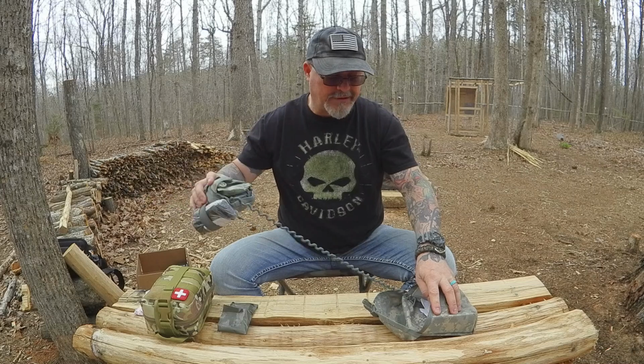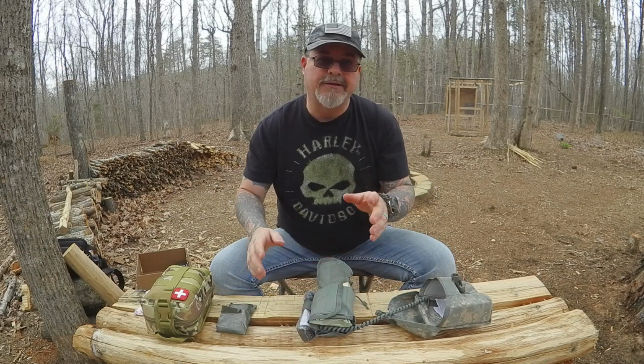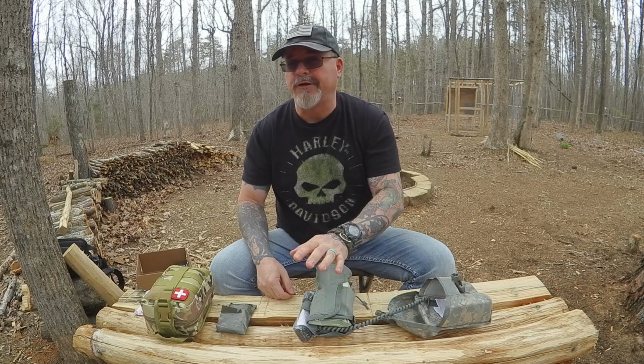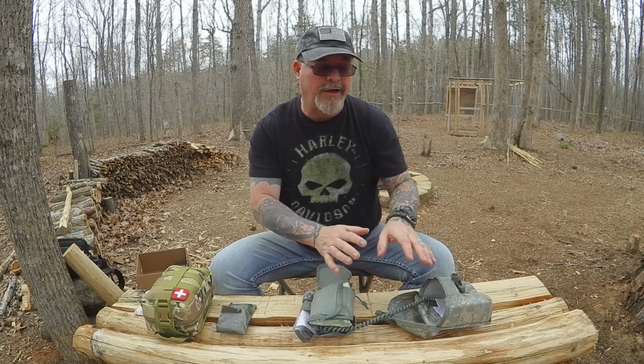So it's also connected to a cord so you don't lose it. Now, the other thing you guys got to understand about these packs is these individual first aid kits. This is a first aid kit for you, not for your battle buddy. So if you are injured in combat, your buddies are going to come over, flip you over to wherever this is at. They're going to open this up, and then they're going to use this stuff on you. They're not going to use their pack on you. They're going to use your pack on you.